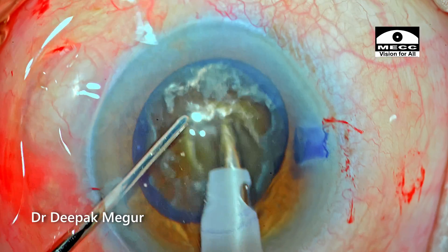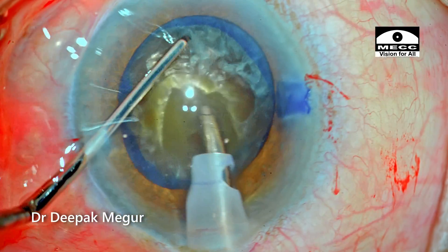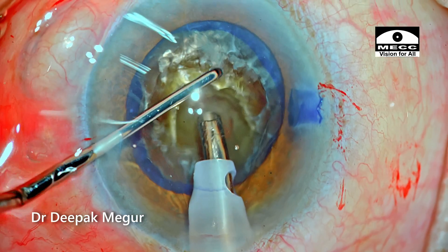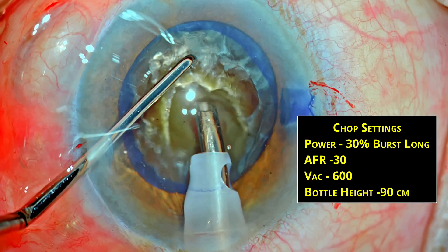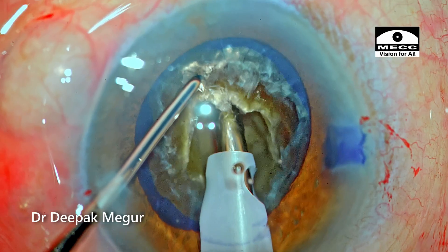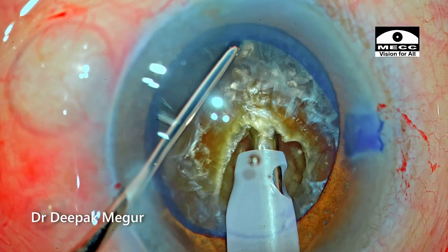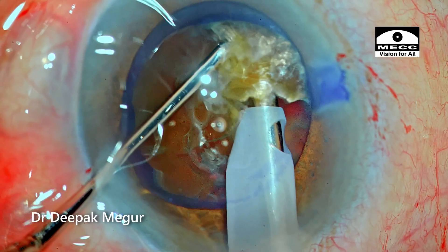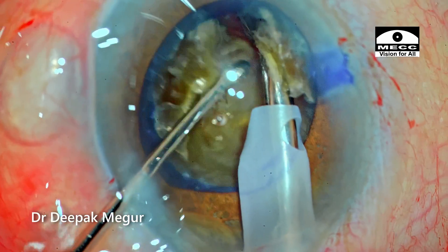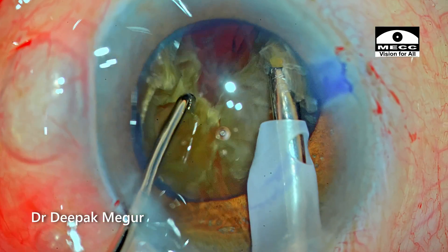The idea is to have a very deep and firm grip at the core of the nucleus. Once the depth is sufficient, I change settings to chop mode. I bury the phaco tip until the exposed part is submerged into the substance of the nucleus. The chopper goes down vertically, then lateral separation movements are performed. The chopper is subsequently placed at progressively deeper planes — first, second, and third lateral separation maneuvers.